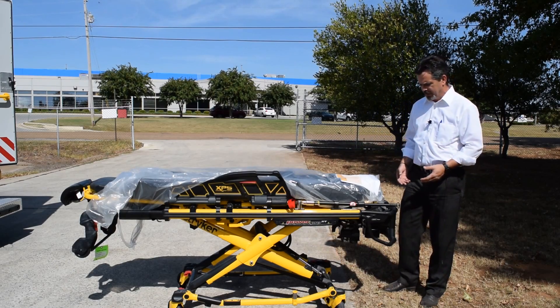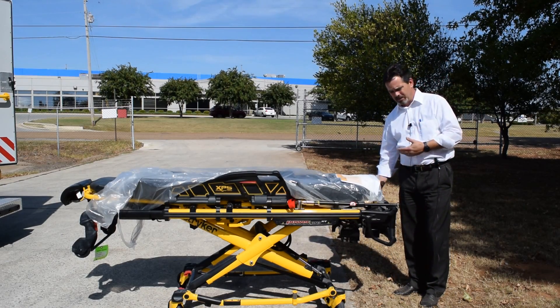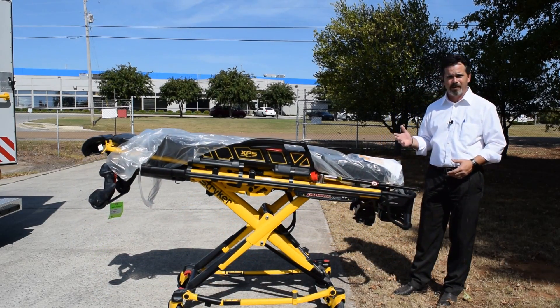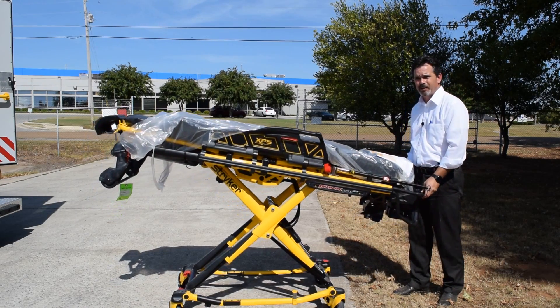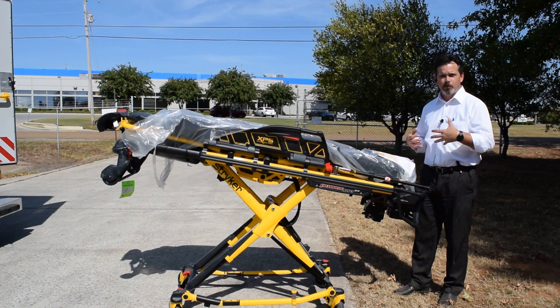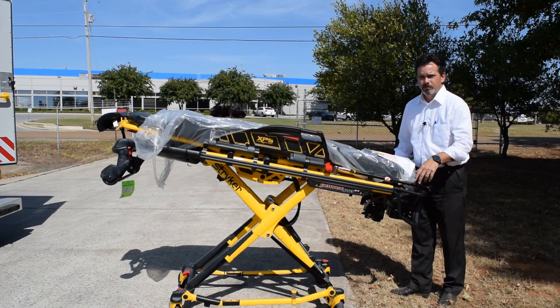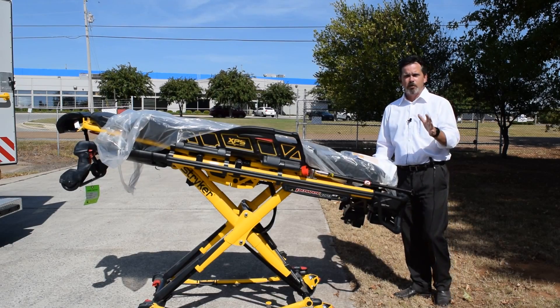When getting ready to load a cot into the ambulance, you'll have a patient on it. Push the plus button on the cot to raise it. Push it until it stops, then push it again and hold it until it goes all the way up.